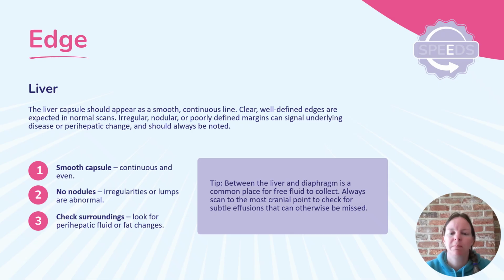So top tip, between the liver and the diaphragm is a common place for free fluid to collect. Always scan to the most cranial point to check for subtle effusions that can otherwise be missed.